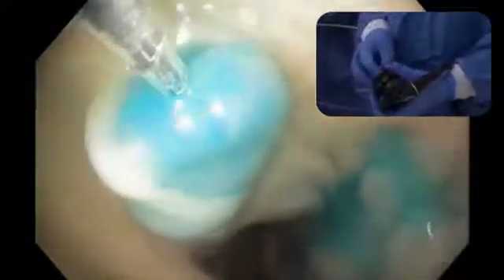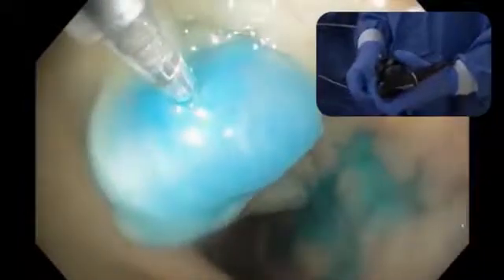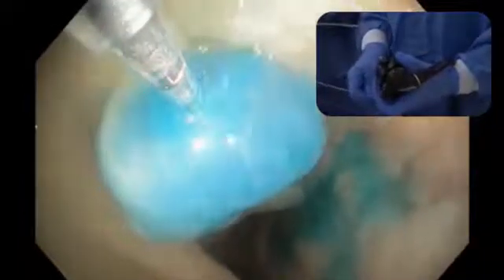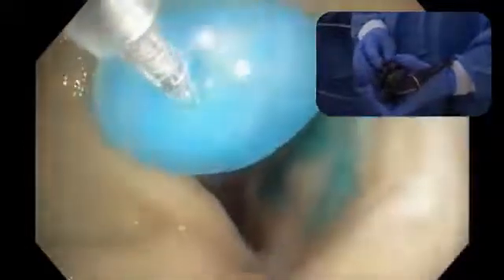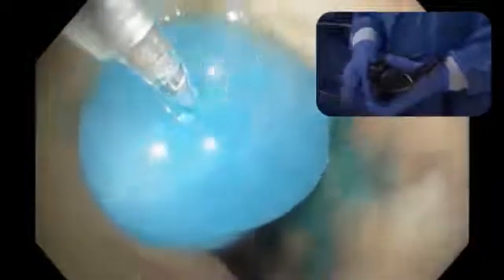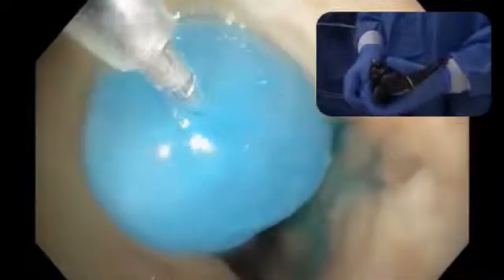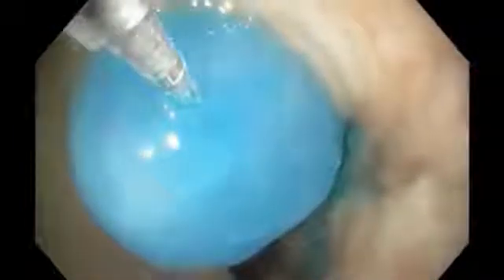Once we see the submucosal bleb, first thing we want to do is start to move away from the site. This is the process of what we call dynamic injection. And we actually can start to move the needle around, direct the fluid sometimes to the right or left, but also we need to pull back on the scope because the submucosal mound is coming toward the scope tip.